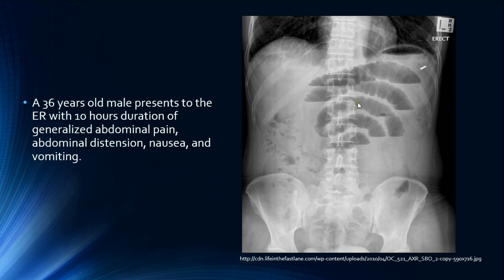Looking for obvious abnormalities, the most striking finding is the air-fluid level we can see in the central and epigastric regions. Since there are valvulae conniventes traversing the whole width of the bowel, and the width of this bowel is more than 3 centimeters, we can say that this is small bowel dilatation.